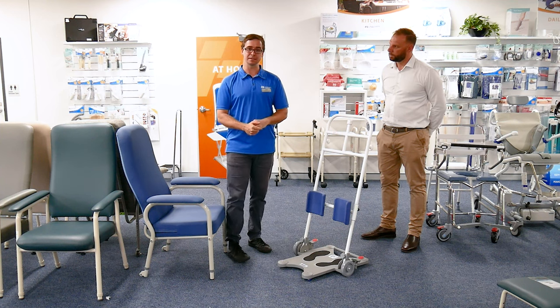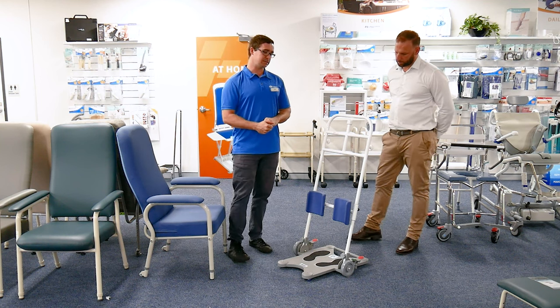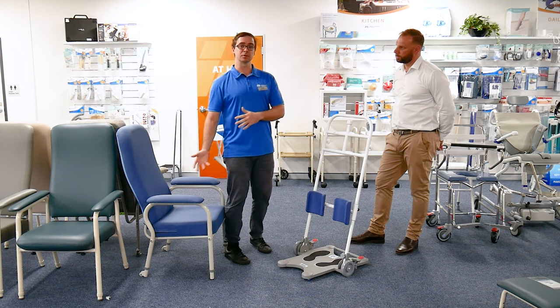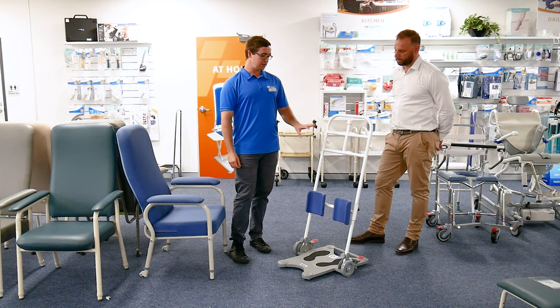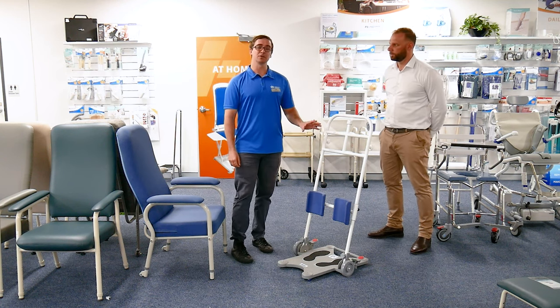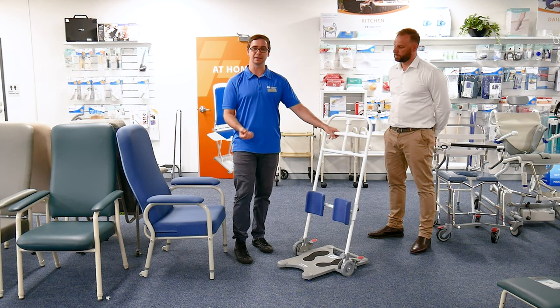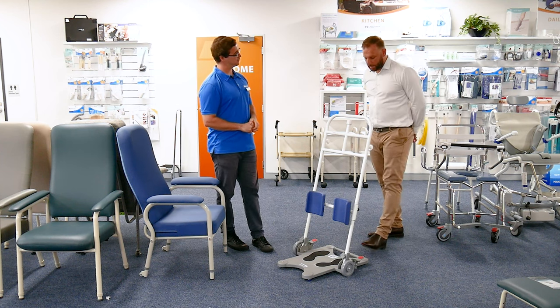Pivot transfers still happen, however they are a risky manual handling procedure. When it becomes a maximal assist — one or two people assisting someone — it's often safer for the carer or support worker, as well as the person themselves, to have a repeatable safe way of transferring. One of the important things we like about these types of models from a clinician's perspective is that it maintains a lot of independence. The person is able to do a lot of the transfer — the standing, the pulling up and sitting back down — themselves.